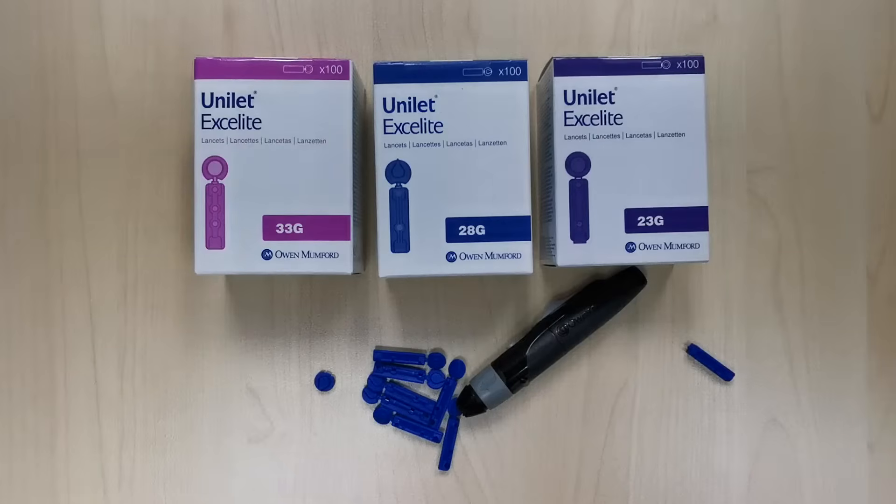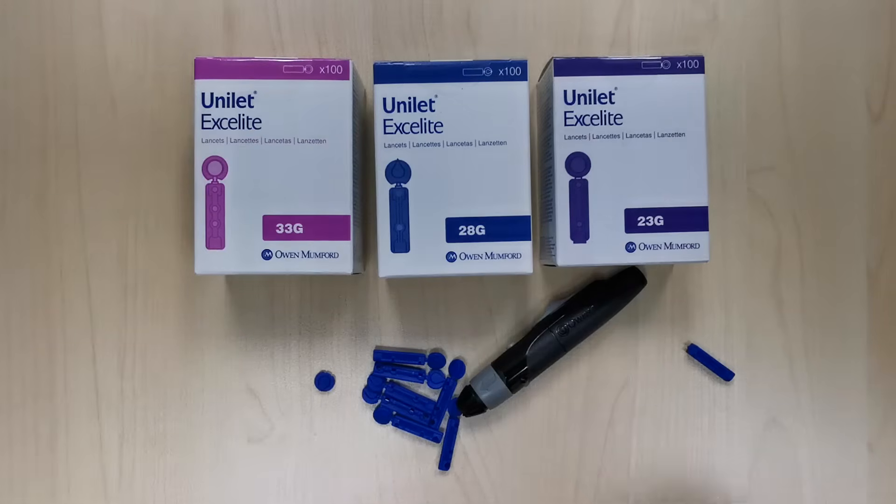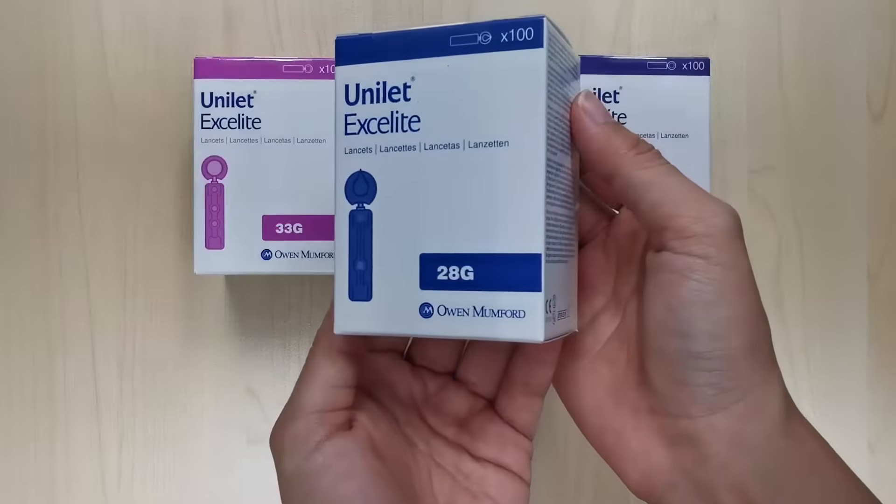They come in different sizes depending on your needs. The bigger the gauge number printed on the box, the thinner the needle, and the smaller the gauge number, the thicker the needle. Generally, 28 gauge lancets like this box here are good enough to get a good amount of blood from your finger.